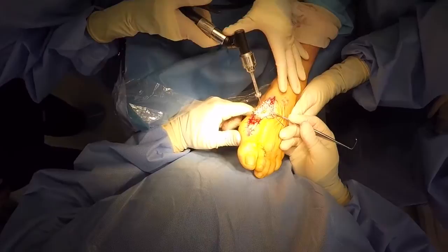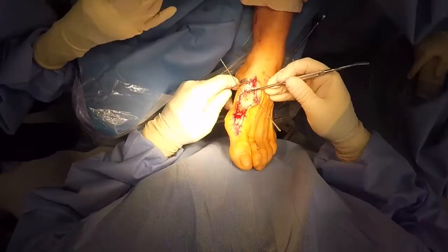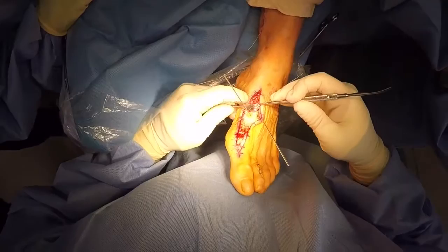For your elevator? Yes, sir. That's plenty. Good. I have to switch now to anything? Yeah. Can I flush that away? Put that drill bit back in there. Be sure it says flush in there, or you may need to ream a little bit more.